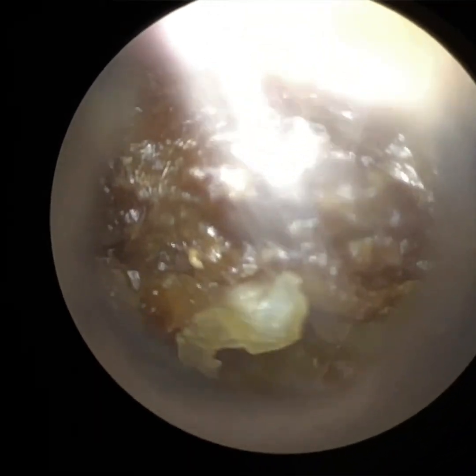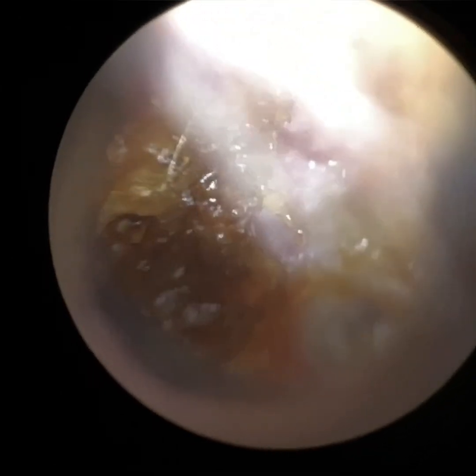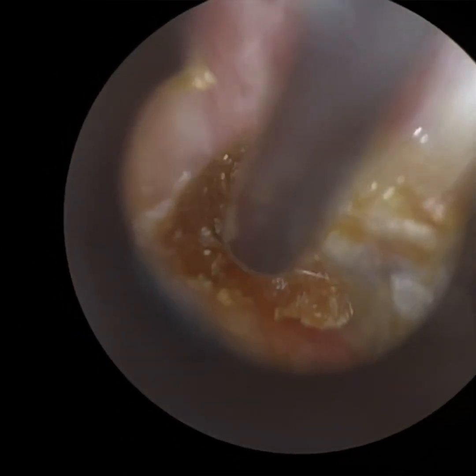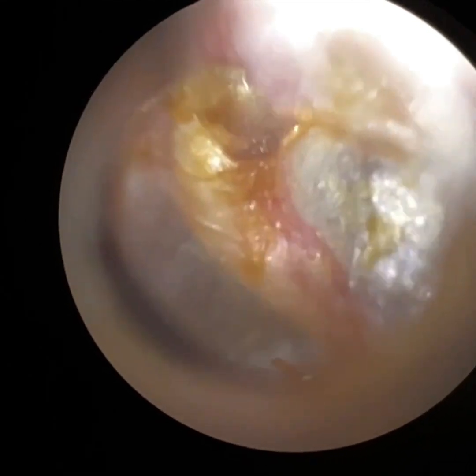Another negative for me with both an operating ENT microscope and head loops is the constant need to reposition yourself or the patient to obtain focus. Both have a very shallow depth of focus — so if you're examining the outer part of the ear and then the eardrum, you lose focus very quickly. There's a constant need of repositioning when visualising different parts of the ear. The Waxcope also has a somewhat limited and shallow depth of focus due to its microscope lens, which doesn't go in the ear.